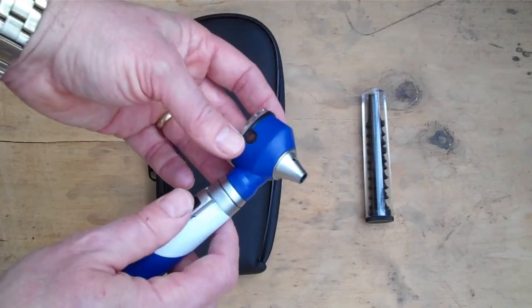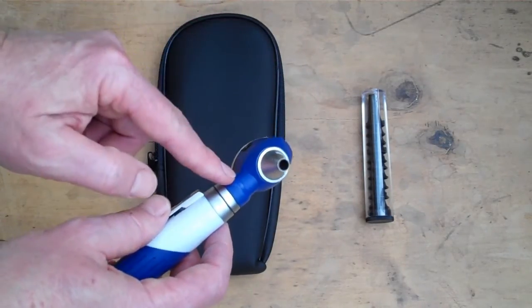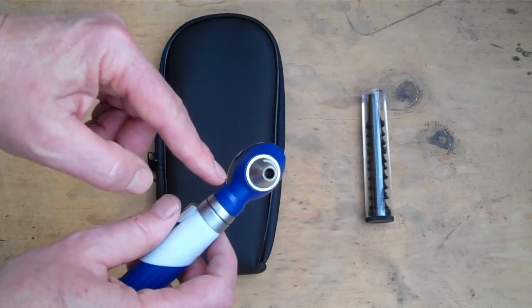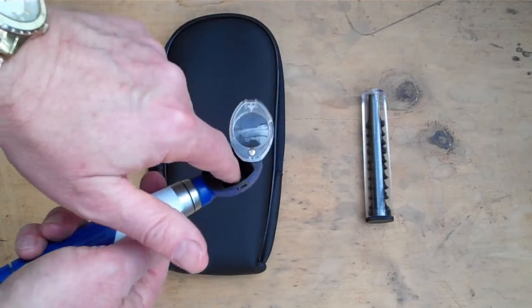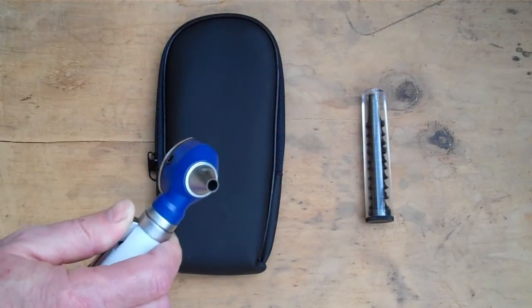There is a retractable magnifying lens and also an insufflation port if you require that function, though very few people do. This is a fiber optic device, so the actual bulb is in the housing — there is no bulb or holder to obstruct your view through the otoscope.